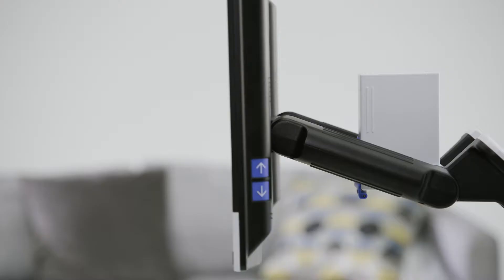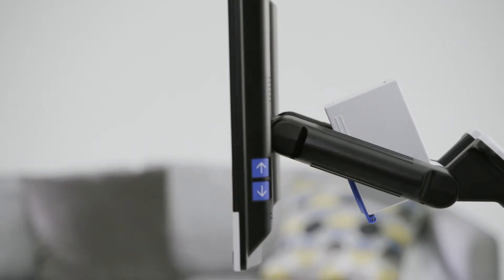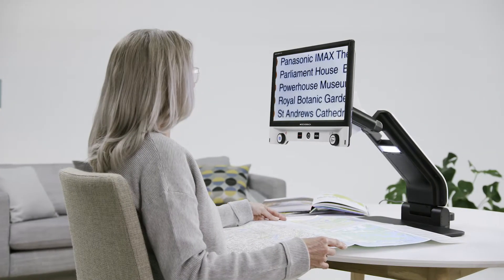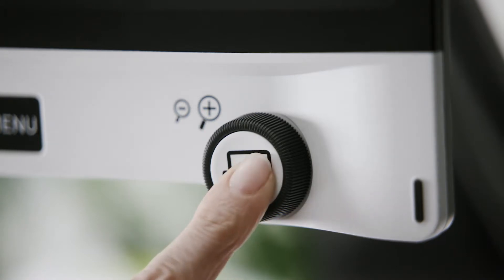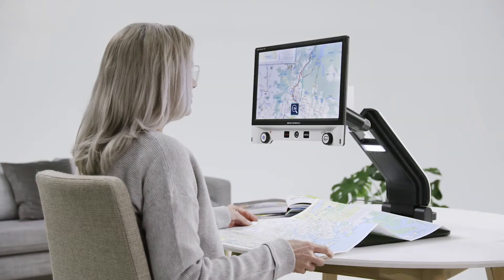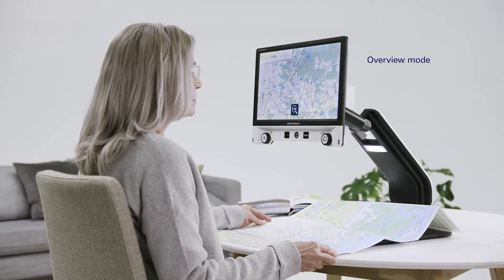The camera can be easily tilted for reading large formats, allowing you to view the upper area of the reading material. A practical overview mode makes it easier for you to maintain orientation at all times, even in the case of high magnification levels. Just press a button to move temporarily to the smallest magnification level.